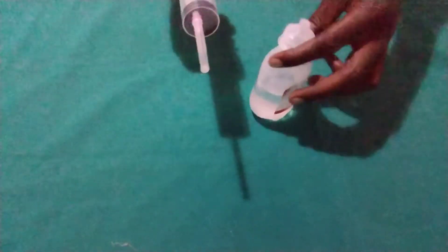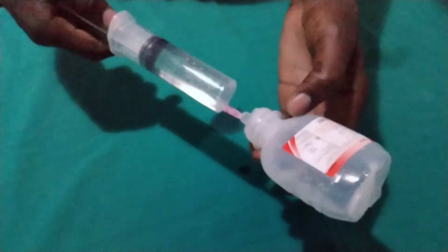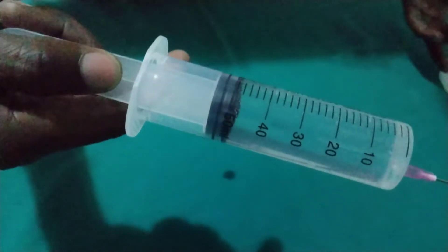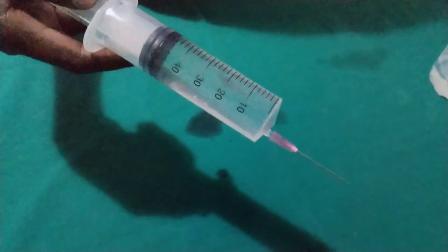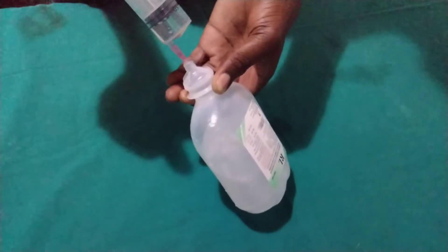So we are going to aspirate our 50 mils of dextrose 50%. Make sure if you are drawing up, there should be enough fluid in your bottle. As you can see, this one is our 50 mils. Then we are going to replace it in our ringers lactate. So this one is our 50 mils.